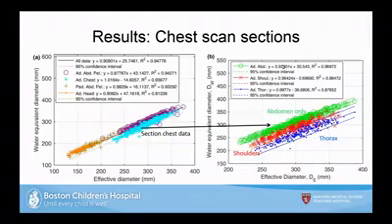So what I did, just to investigate, was I sectioned the chest data. I sectioned it into abdomen only, then thorax region, and then shoulders only for each patient. And I plotted the mean of those separately. So over here, you can see the abdomen only, and as I expected, this line and this linear regression agree quite well with what we find for the overall data.